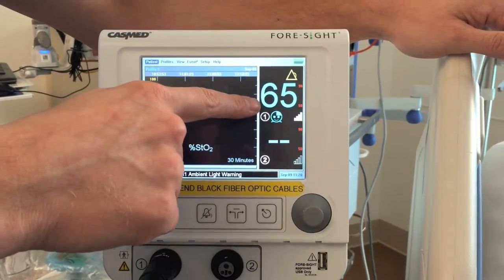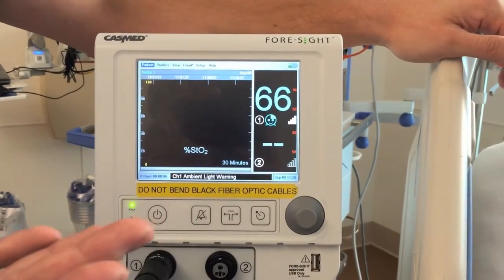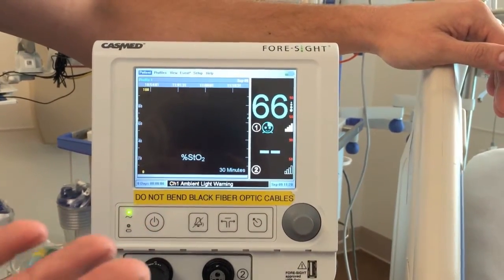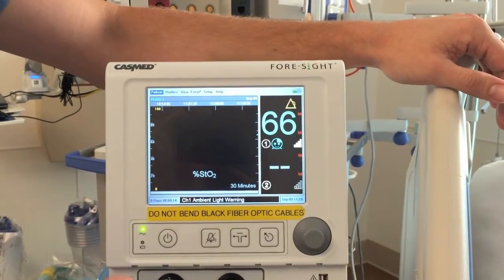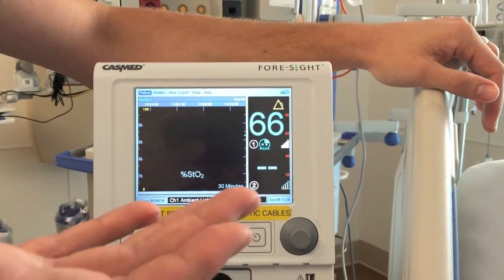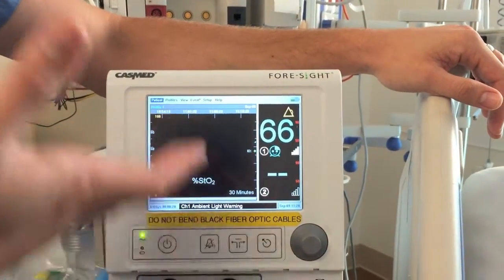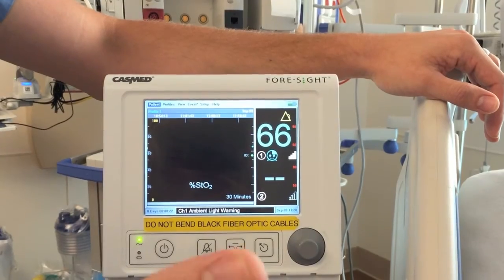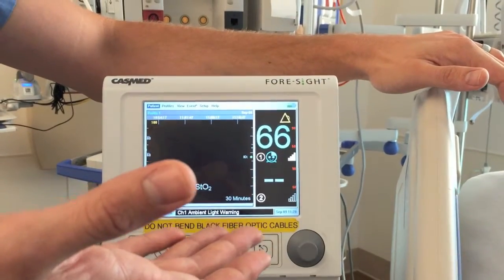Now we have our first reading of 65. The normal reading you're looking for is typically between 55 and 75. The NIRS is indicated for patients who may have a brain injury or where you're concerned about oxygen consumption in the brain — you can think of it along the lines of a mixed venous sat. Our goal is 55 to 75, so we're right where we need to be.